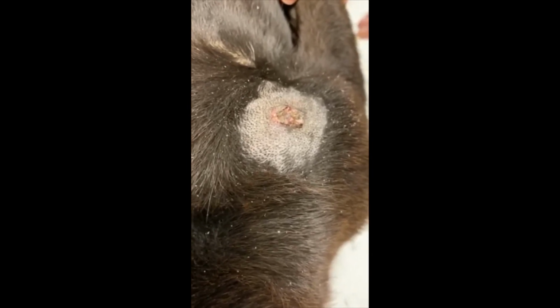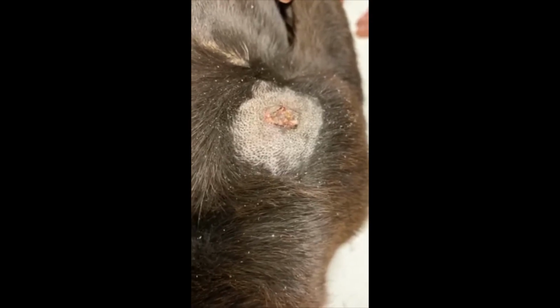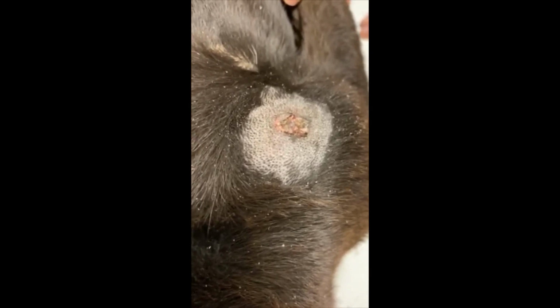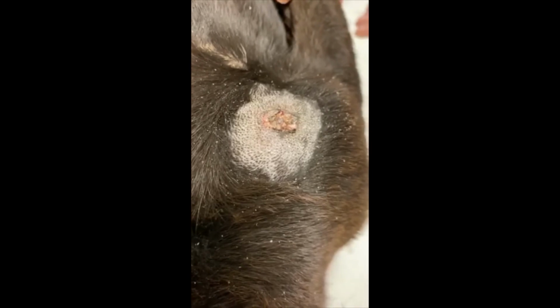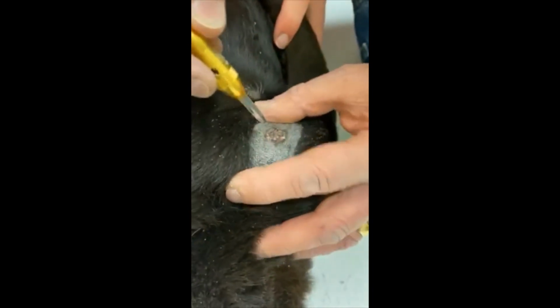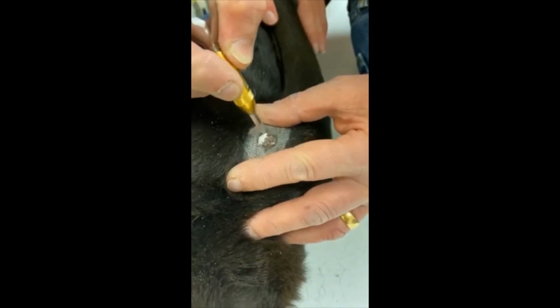Please, if you see a mask and other alternative gear on, it is not for the specific purposes of treating these lesions. It is because we are following a coronavirus or COVID-19 protocol. So we're going to start on one edge of the lesion. We're going to check our time, and again, approximately 45 seconds.